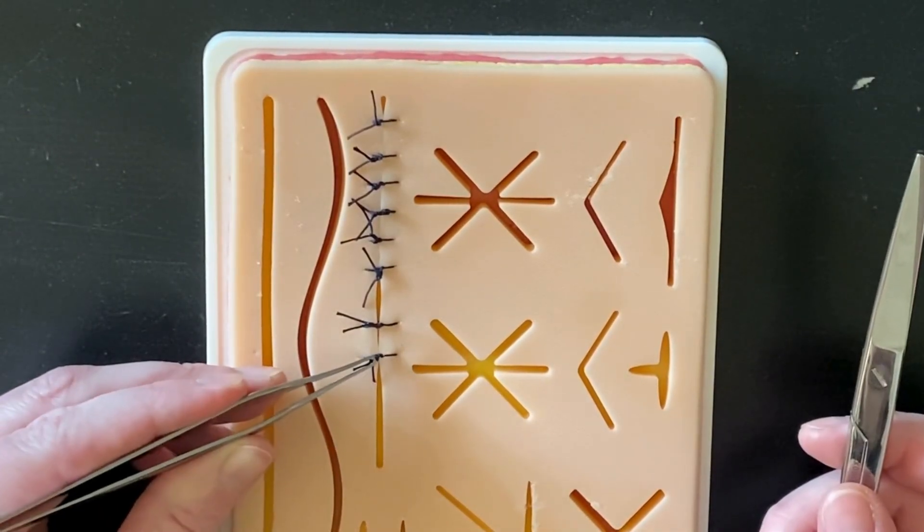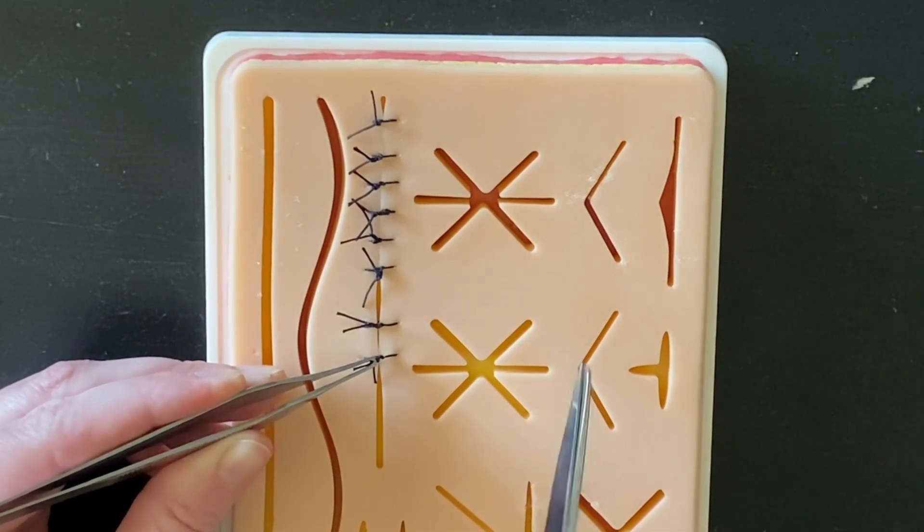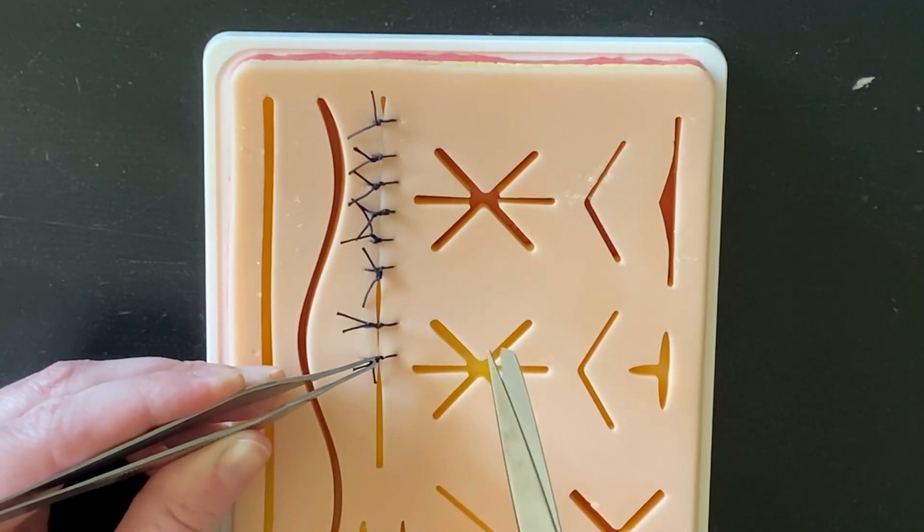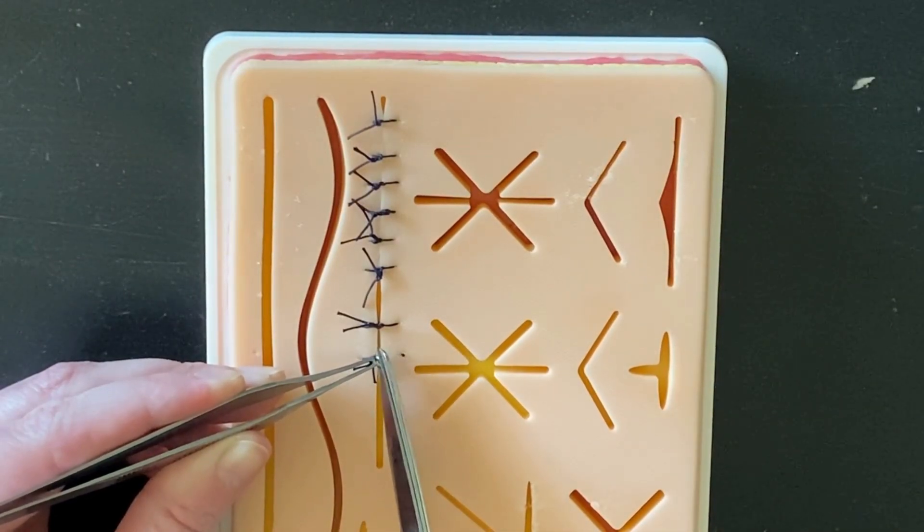Usually what I'll do is pull up on the knot of the suture, which gives you a little space between the skin edge and the knot. I'll insert the small end of the suture scissors just underneath there and cut pretty close to the knot.